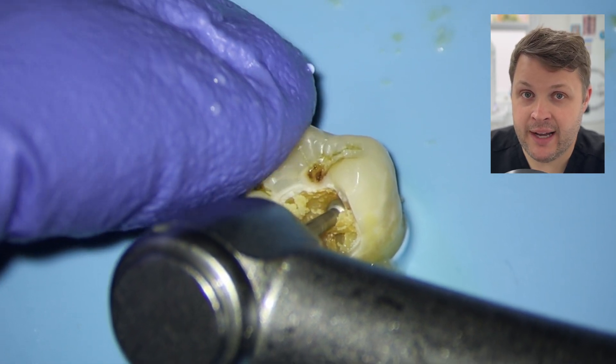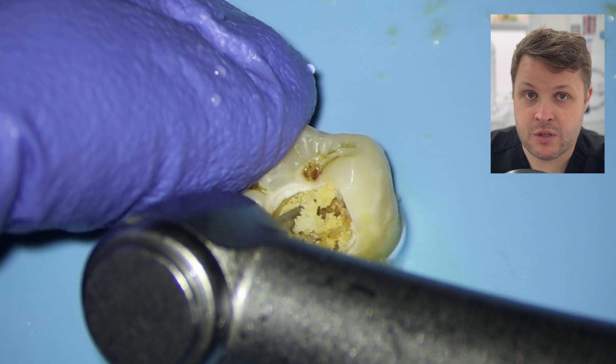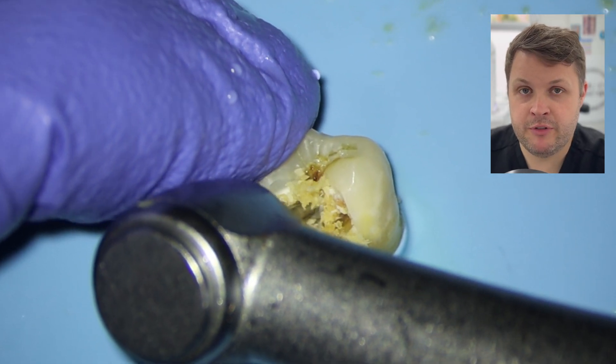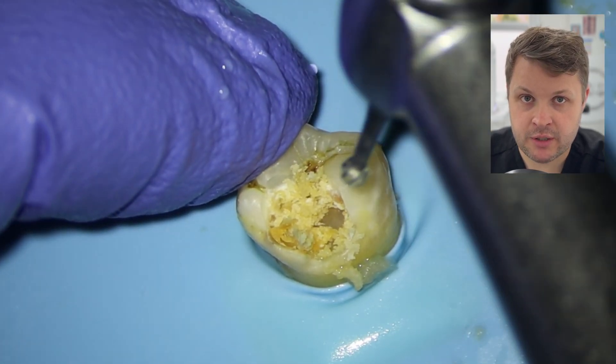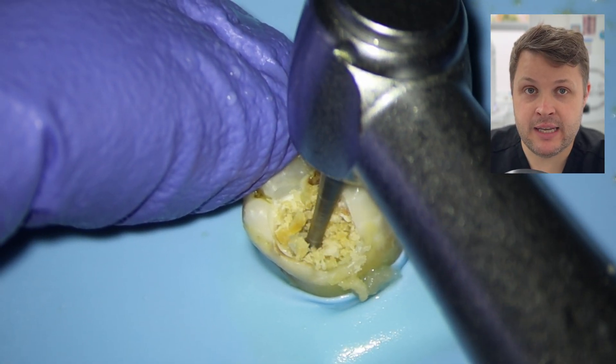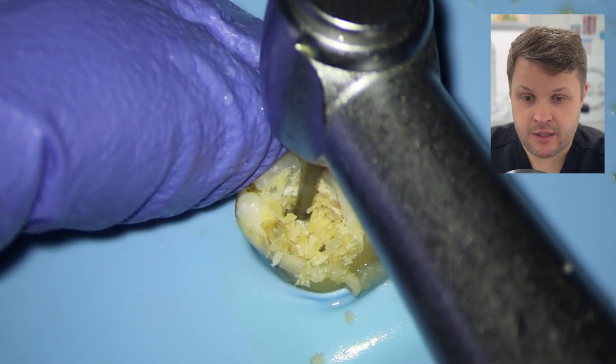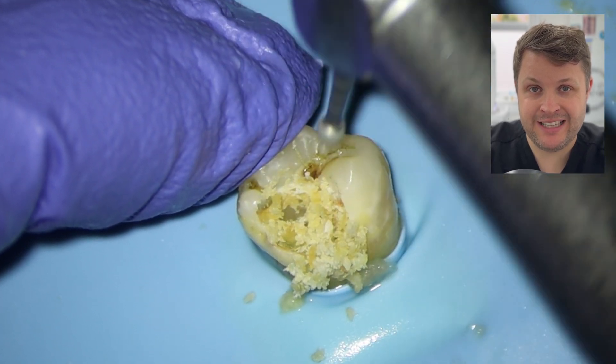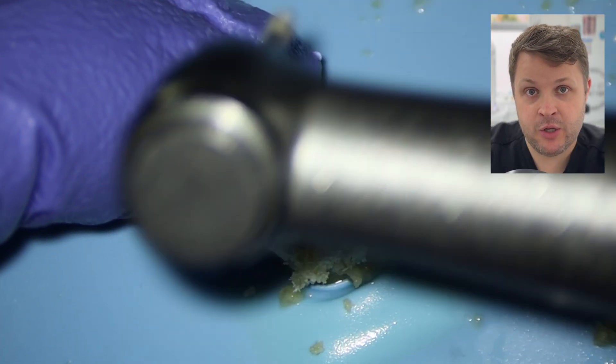Sometimes this can take quite a long time to remove most of the decay. What's really, really important is that you remove the decay from the DEJ — or the dentin enamel junction. Sometimes this can be difficult to see because a lot of the enamel is going to be intact, but the decay is going to be underneath that.